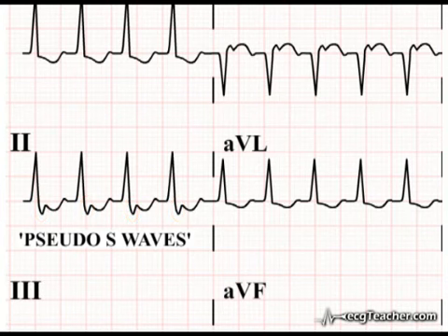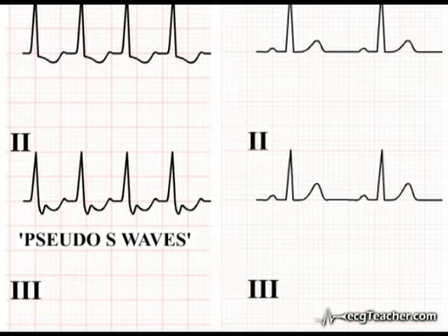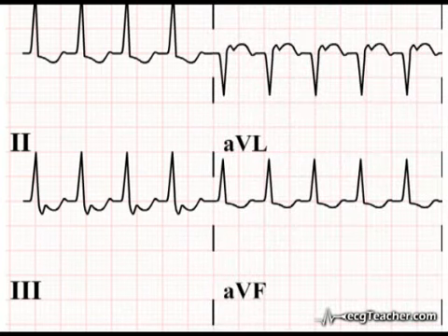The complete absence of S-wave activity in lead 2 in the pre- and post-attack ECGs supports the contention that these are indeed pseudo-S-waves. As we've seen, this pattern of atrial depolarization supports the contention that the abnormal depolarization focus is junctional in location. At a heart rate greater than 140 beats per minute, the nature of the depolarizing focus within the junctional region is reentrant.